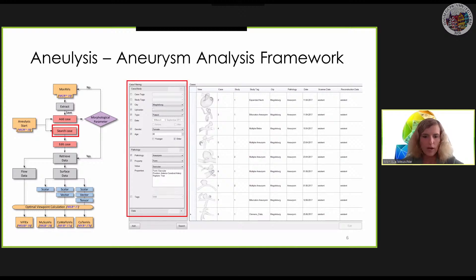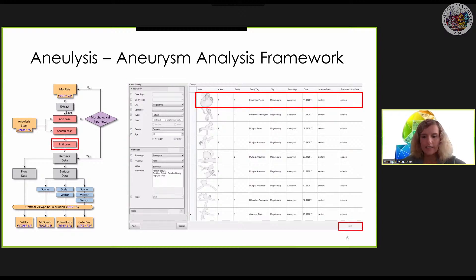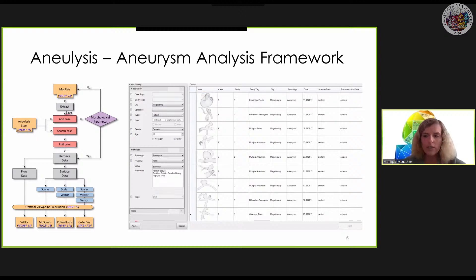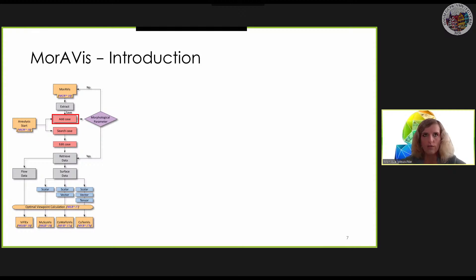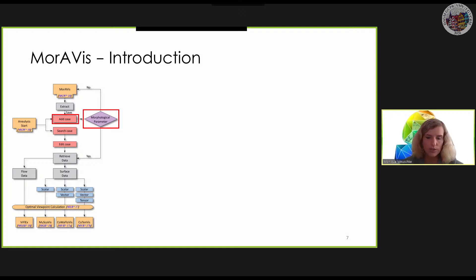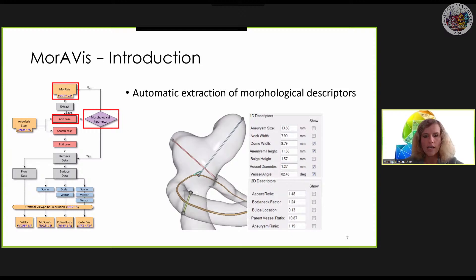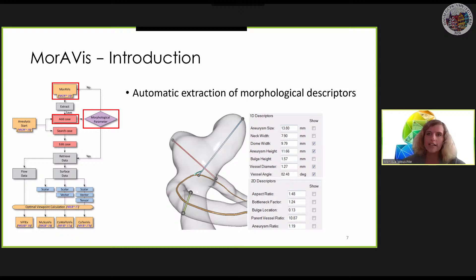It is possible to search for specific cases using filtering masks. An existing case can be explored or new data sets can be included. For new cases, morphological properties are automatically calculated using the first module — the Moravis module. These morphological properties are then visualized within the vessel geometry, whereby the exact quantitative values are also displayed, so the user can interactively explore the individual morphological descriptors.